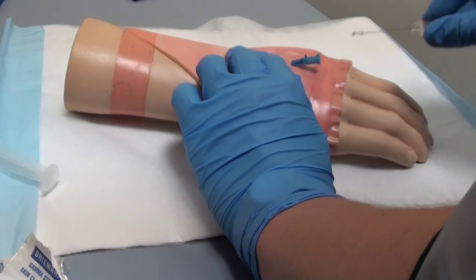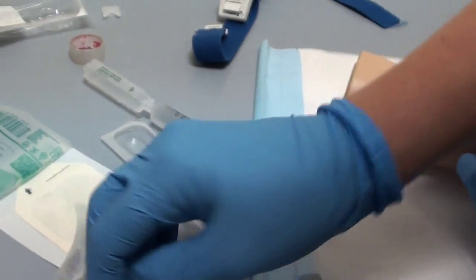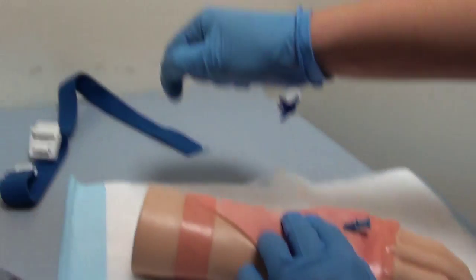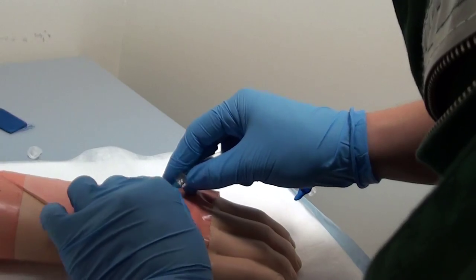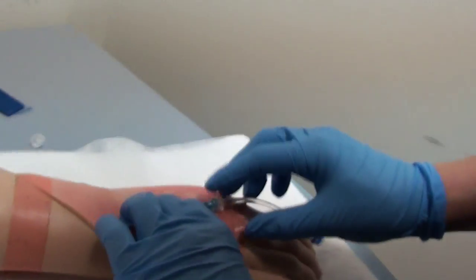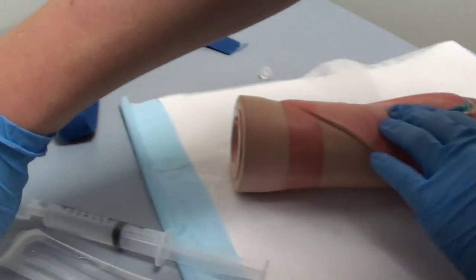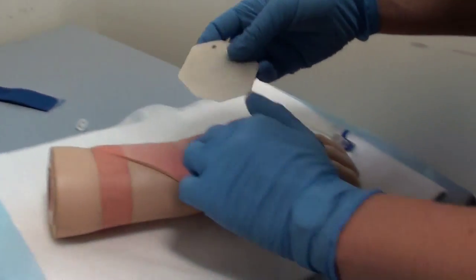That's fine. Then, sharps out, and sharps away. I'm now going to attach the three-way onto this, which I've already primed because it's normal saline. Just one mil. And I'm going to secure this cannula in place as soon as possible.